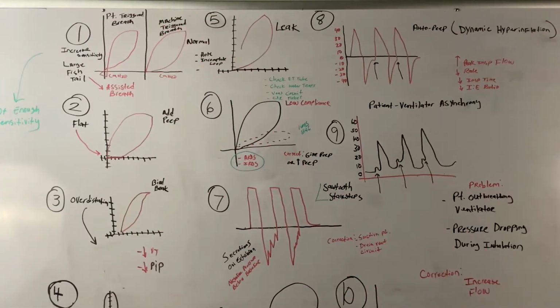Okay, guys, I'm back, and I couldn't stand in front of the board so you can hear my voice. Let's do this. These are the things that you need to know for the TMC exam when it comes to ventilator graphics. There are literally hundreds of graphics that they can show you, but I can assure you that there will be a combination of these on the board that you will see on the exam.